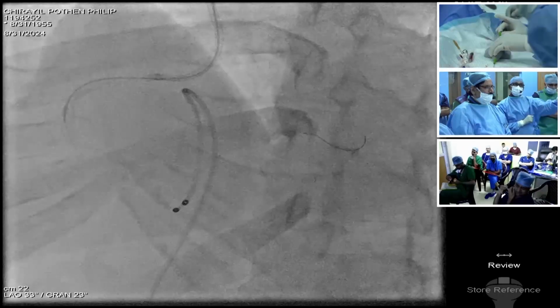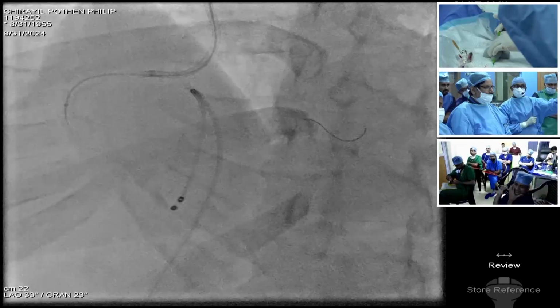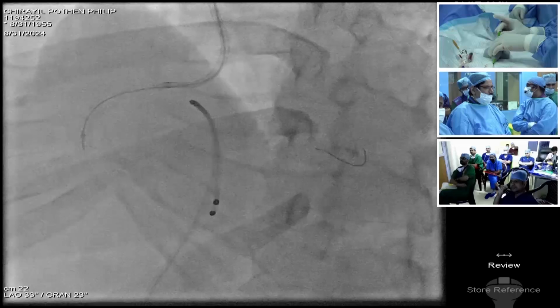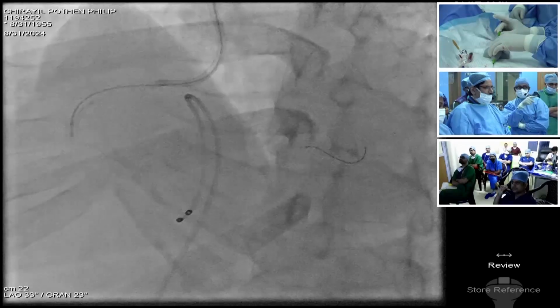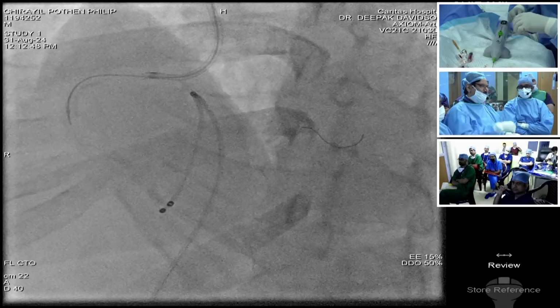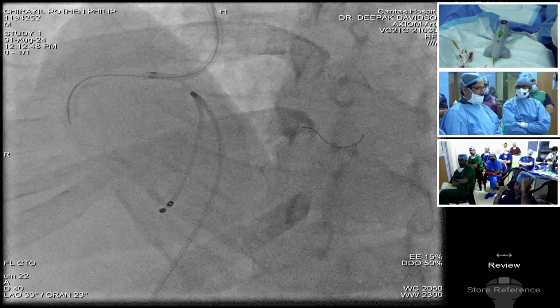Even though the lesion is seen till low down there till that branch, we do not see too much of calcium down there. So probably there is no point in going till there. Probably we'll dwell more in these particular areas where we see more of calcium. We can do retrograde. And once again at higher speeds we'll go in with the wire pullback.